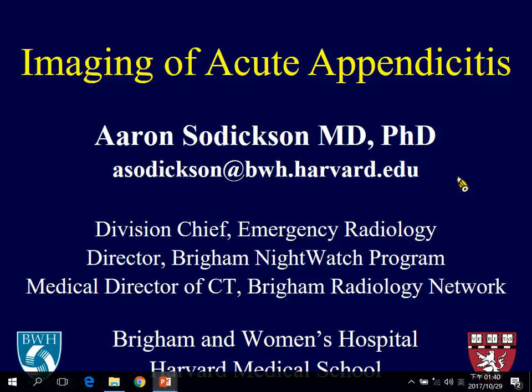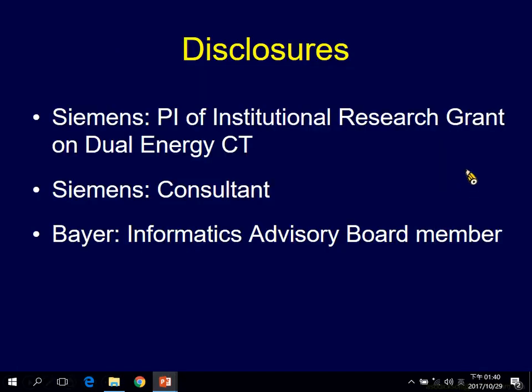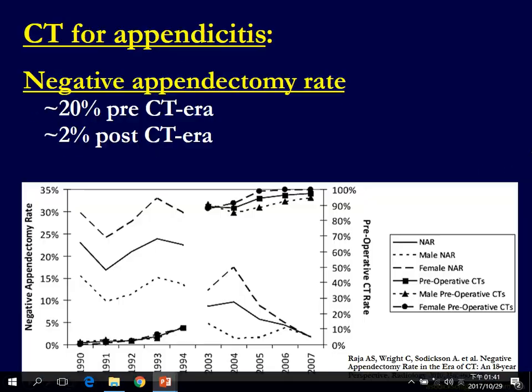The fun of this is that appendicitis has such a broad spectrum of appearance that I think it keeps us alert when we're reading these cases. So, same disclosures, none of them are relevant here.